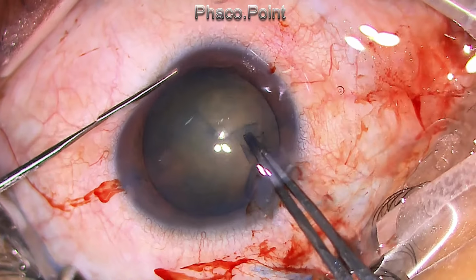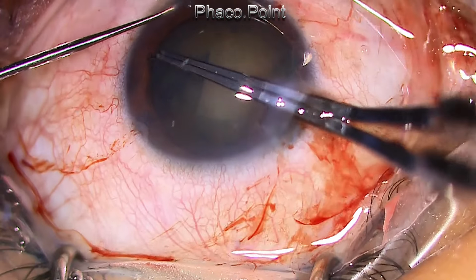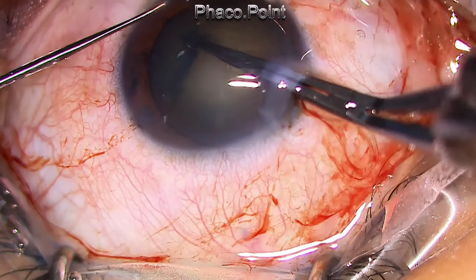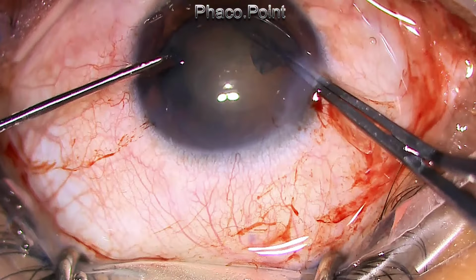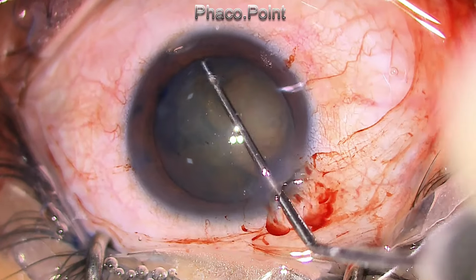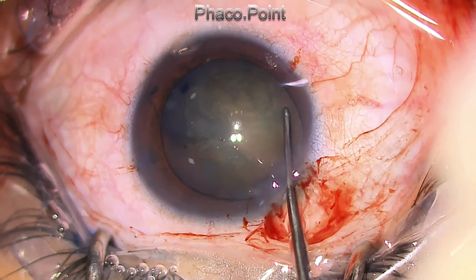This was the other eye of the same patient, and in this case I found that the capsular rhexis was more easily accomplished using forceps. Although the capsular rhexis tended to be a little small, just about 4 mm, I decided to put the CTR in. I created the space.